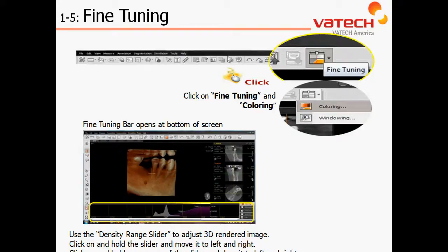In the upper right-hand corner of the EZ3D software is an icon identified as Fine-Tuning. Simply left-click on the option, and then from the drop-down menu, left-click on Coloring. This will open a scale at the very bottom of our window, which will allow us to perform those three functions: changing our density range, the color range, as well as modifying our opacity or increasing our transparency of our anatomy.